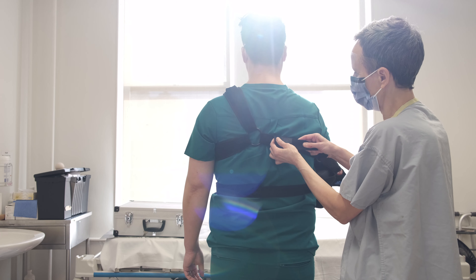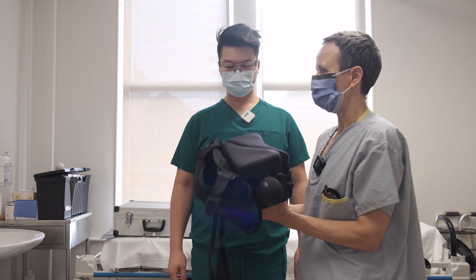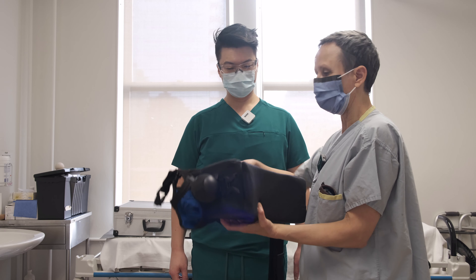You can adjust this to make it nice and snug so you're tucked in. Now, once it sits nicely and you're going home from the hospital, when you recover you'll need to come out of the sling to wash and to change your shirt. The only things you need to do are undo the clip and undo this clip, and you can come out of the sling — just slide out. If you're alone, it sometimes helps to park your arm on a table so you don't accidentally do something.